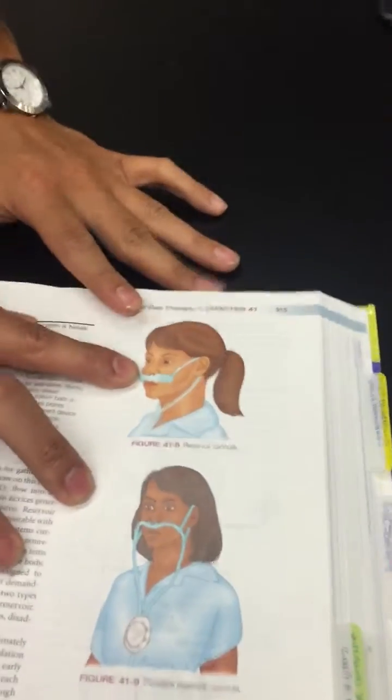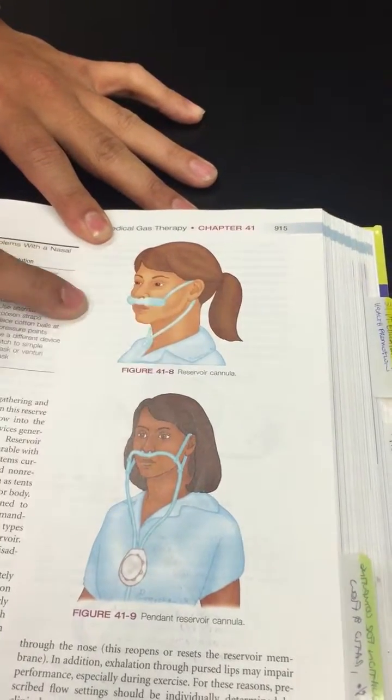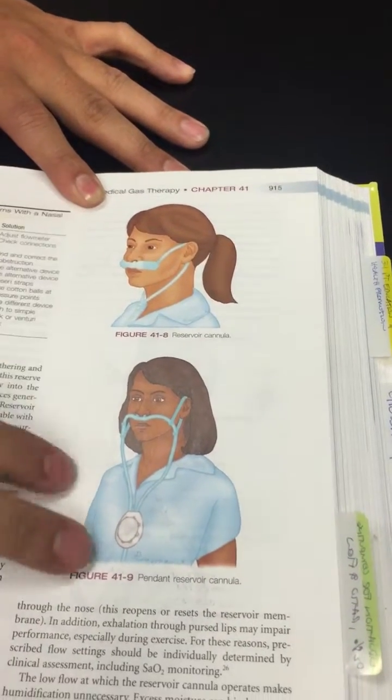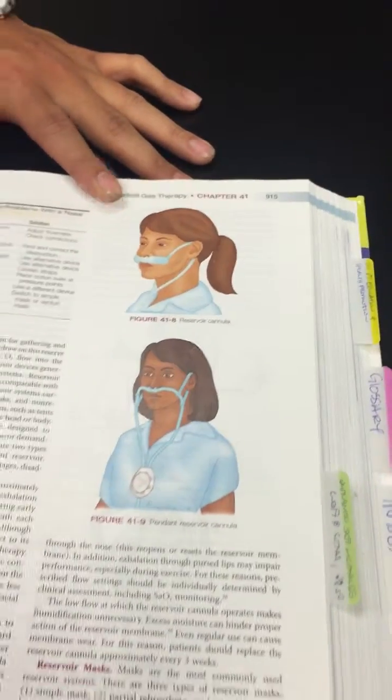We have this one right here, and it has the reservoir over here. It looks kind of like a mustache. Then you have your second one right here, which has a pendant reservoir.